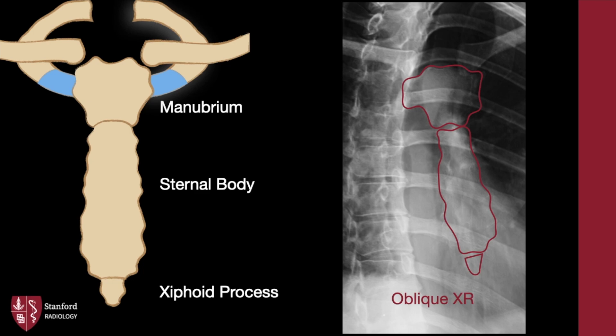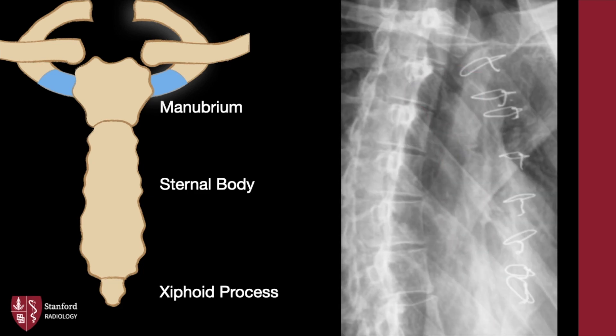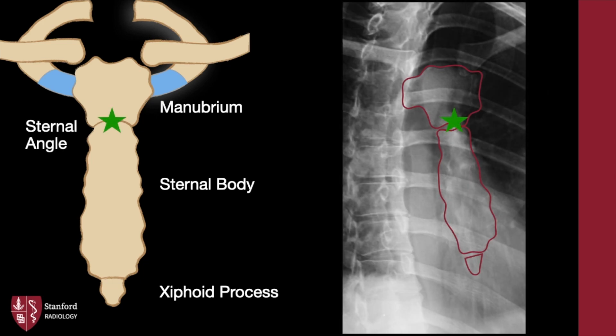The sternum is difficult to visualize on a true frontal radiograph because of multiple overlying structures. As a result, a dedicated view of the sternum requires oblique positioning. Check out this comparison study, wherein median sternotomy wires nicely outline the border of the sternum. The first important landmark is the sternal angle at the manubral sternal junction. Next is the jugular notch, a palpable landmark at the base of the ventral neck.